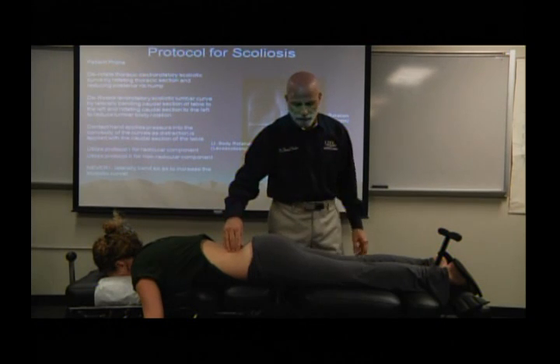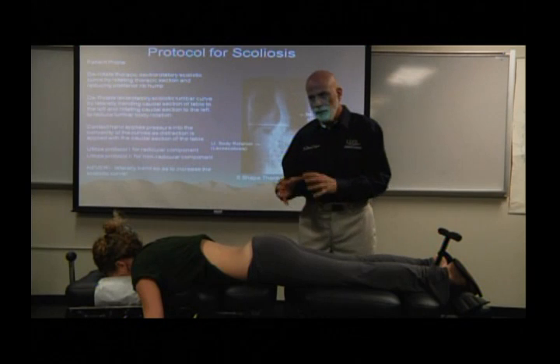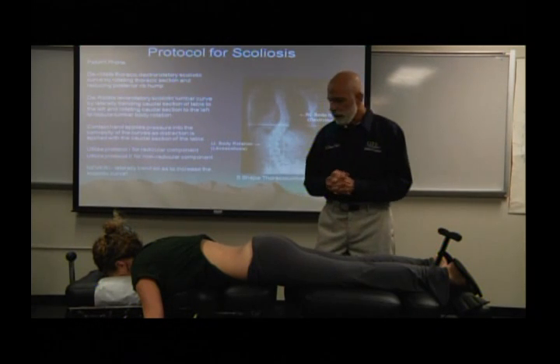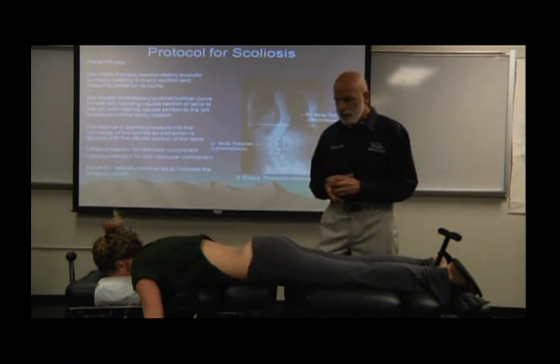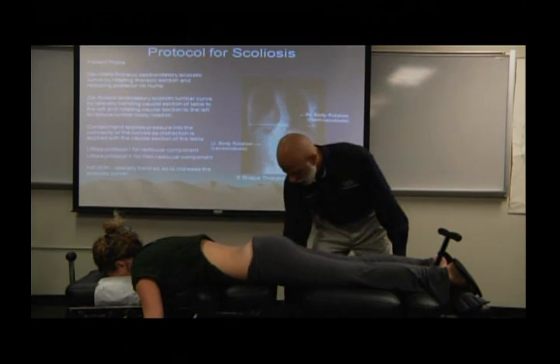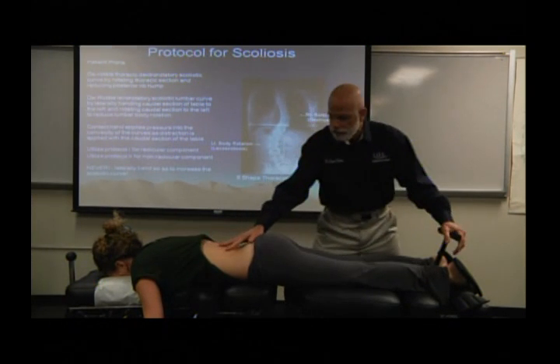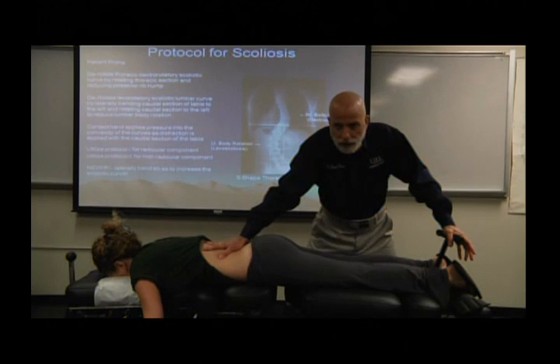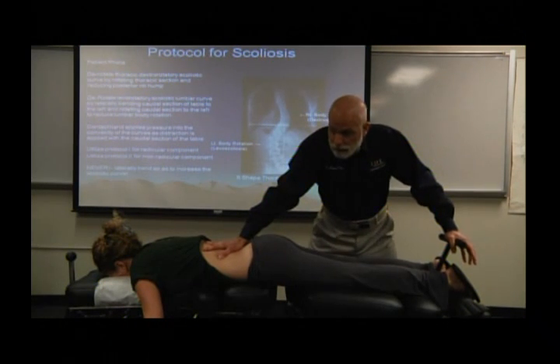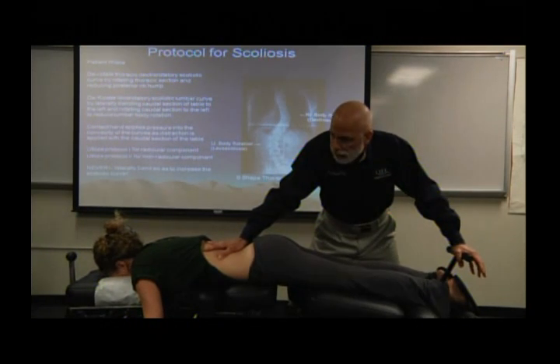We discerned that L4 was the offending vertebra. There was no radicular component, so we wanted to go in and recondition or mobilize L4 using Cox Protocol 2. We basically release the flexion lever. It's already released. Release the lateral flexion lever and get a contact on L4 and do your 10 2-second pumps in flexion. Okay, all right.